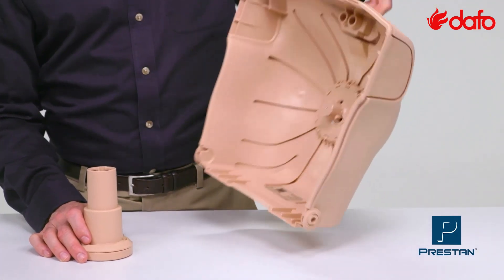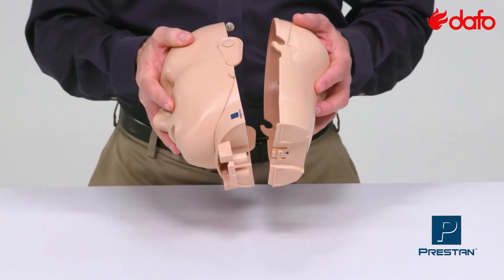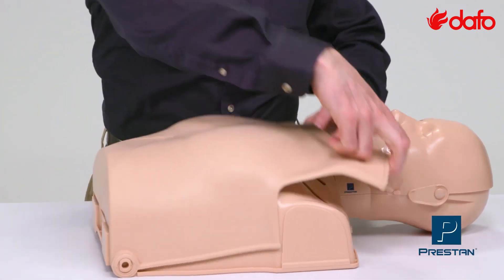Simply attach the piston, assemble the head, insert the lung bag, and you're ready to train.